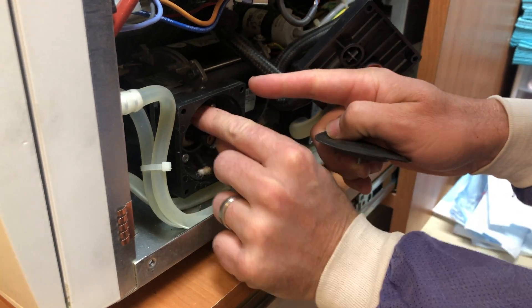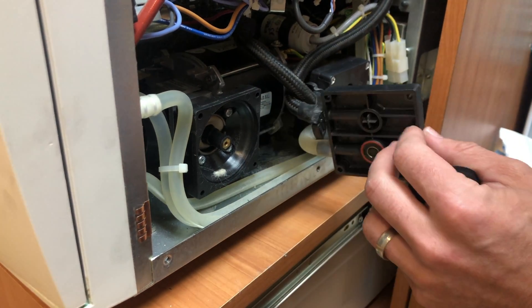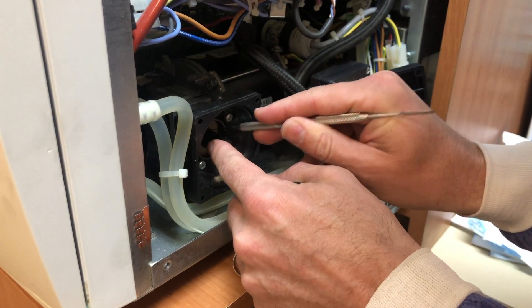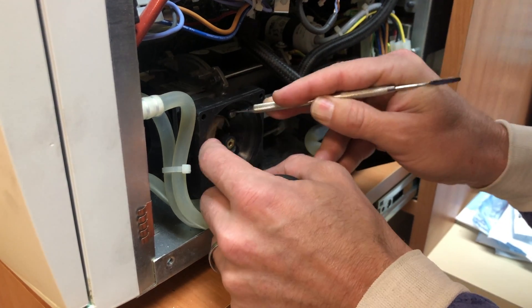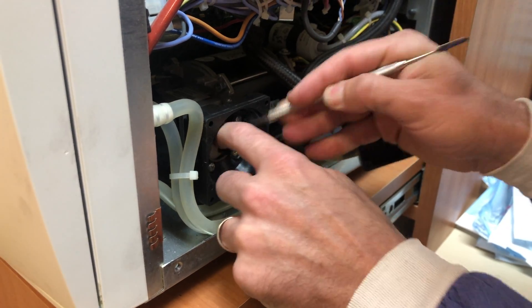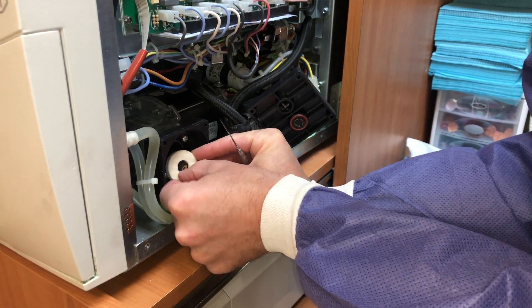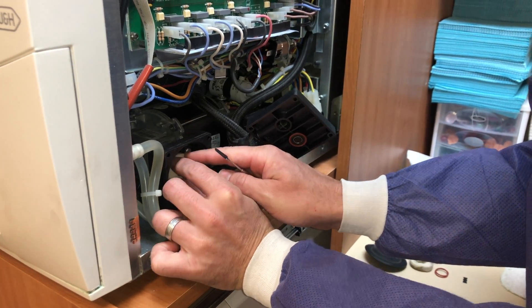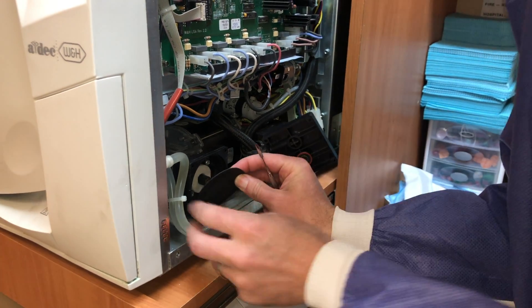Then you take out this little component — I don't know what it's called, but they give you a new one in the kit. So you take this out and then you put a new one on. This is a new little felt pad — we'll stick this in. And then we're going to screw in the new one and it just screws right in.